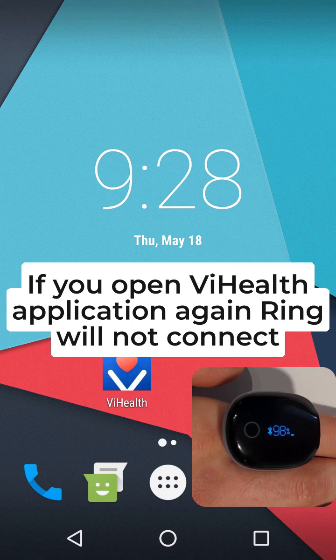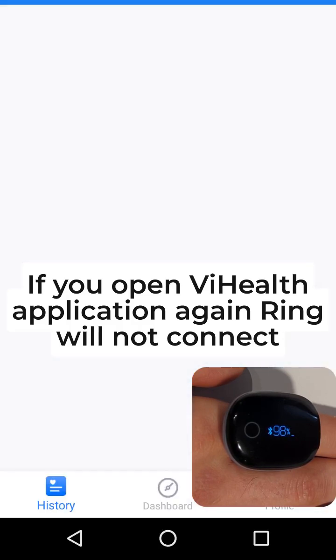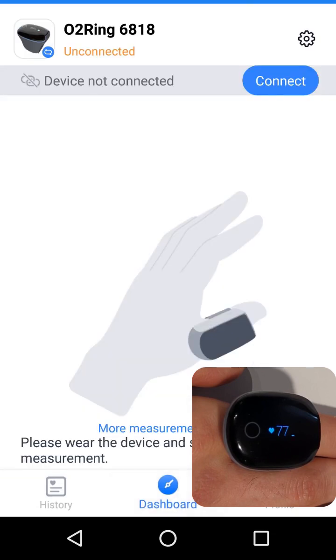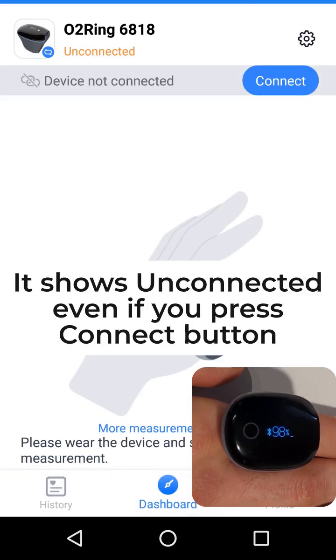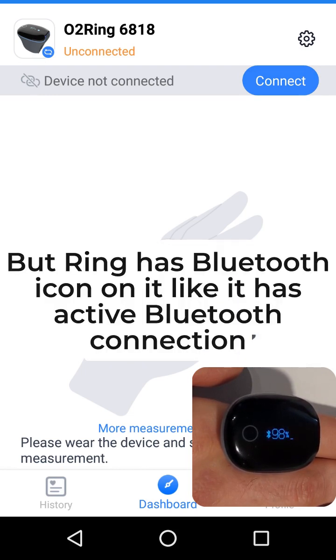If you open the Vi Health application again, the ring will not connect. It shows unconnected even if you press the connect button. But the ring has the Bluetooth icon on it, as if it has an active Bluetooth connection.